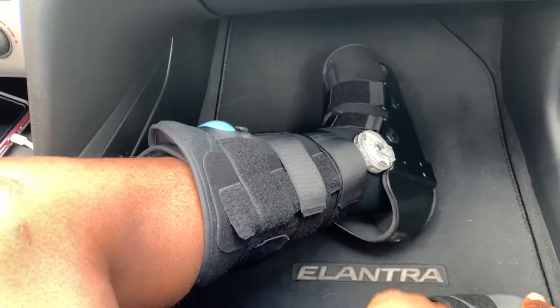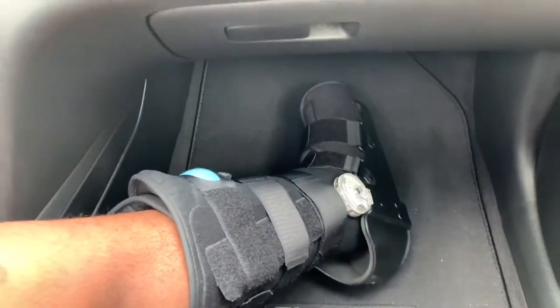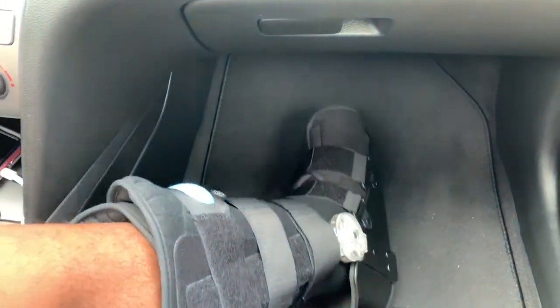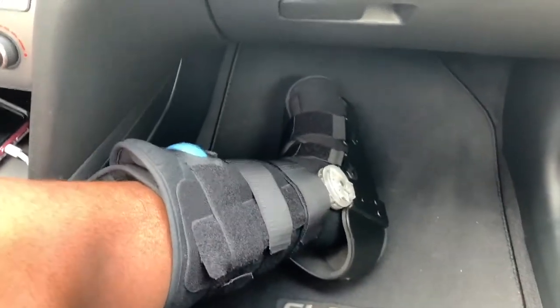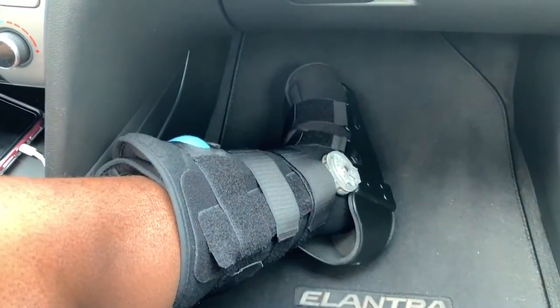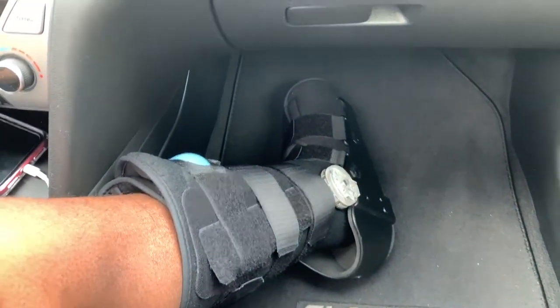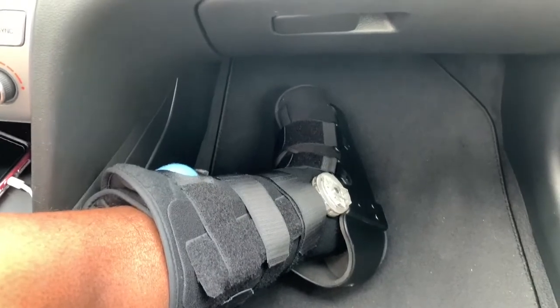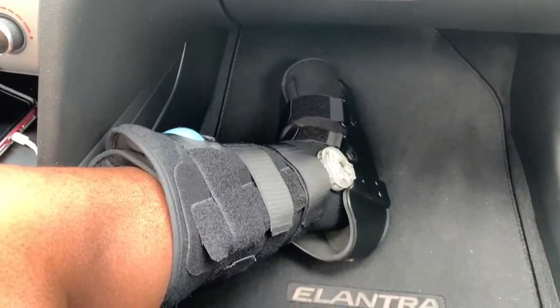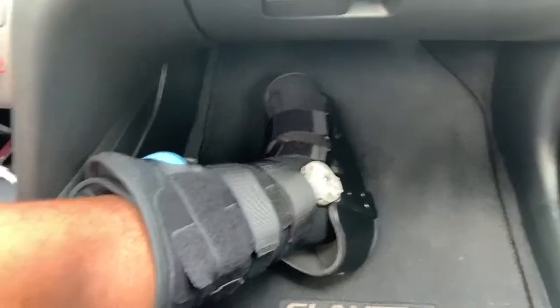It's easier for me to get in the car and ride around because I can put my foot in more positions. When I had that splint, I could only have it in one position. But this one I can move it around. And it's more secure when I'm on my knee scooter — I don't have to worry about nobody bumping into the back of me, or if I slip and put my foot on the ground, this is more secure so I won't re-injure myself.